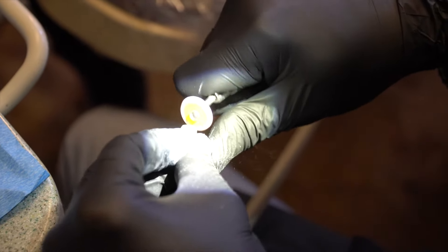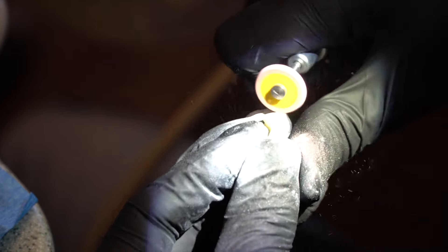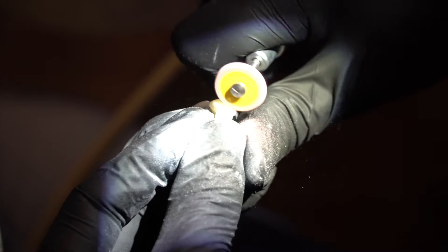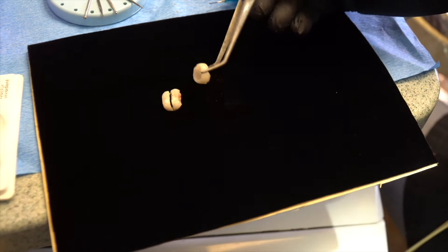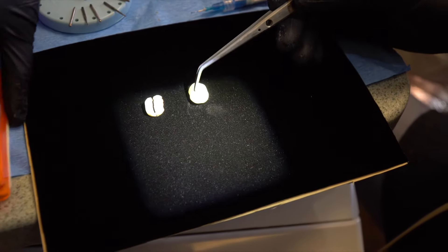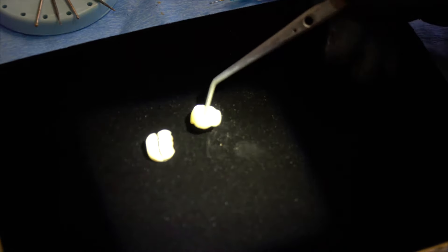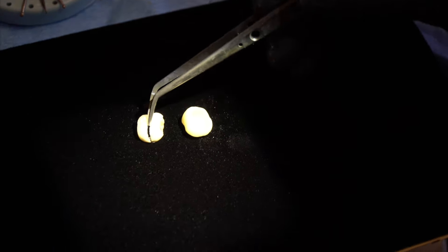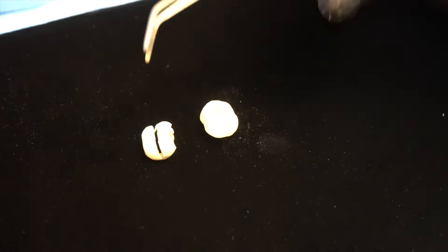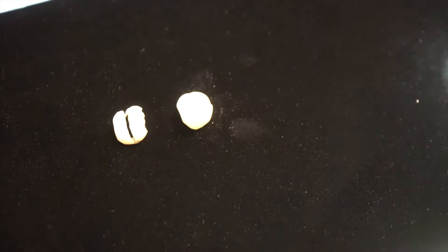We're now polishing. It's important that these margins have a good image so this is going to create a really nice seal, and it's going to last a long time versus the previous crown that didn't do so well. That can be due to a lot of things — the way the impression was taken, the way the crown was delivered. But you have to try to control every variable to get the most predictable outcomes.